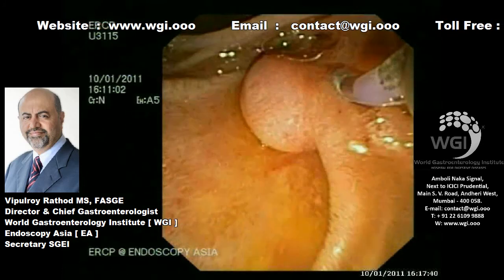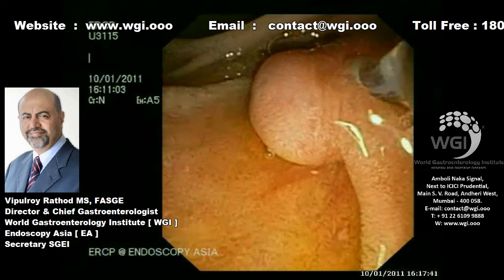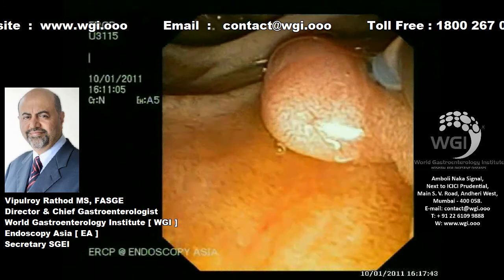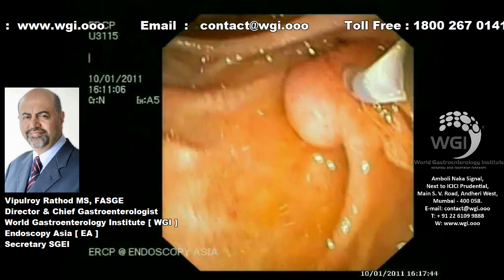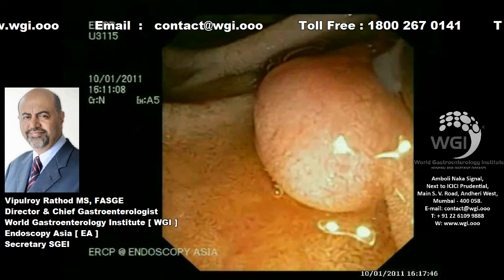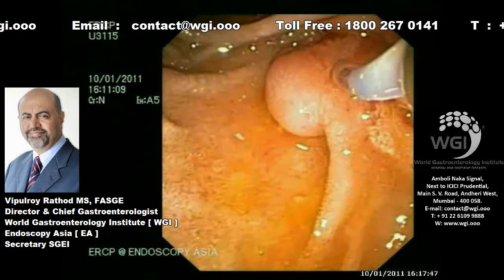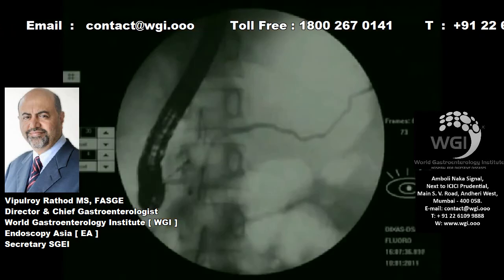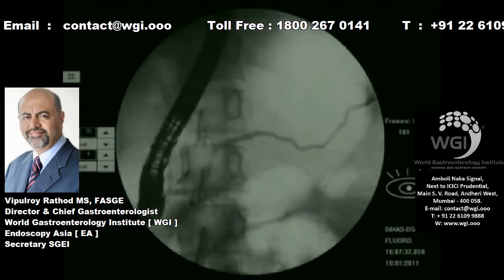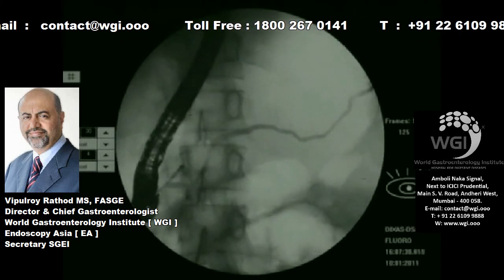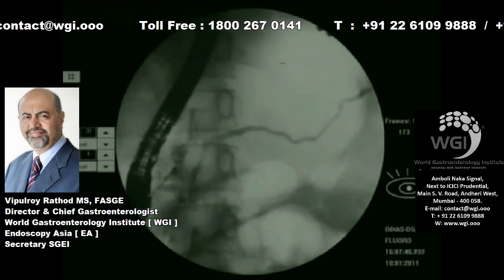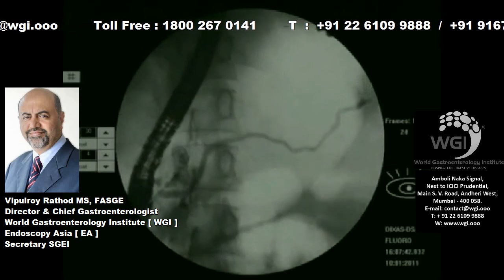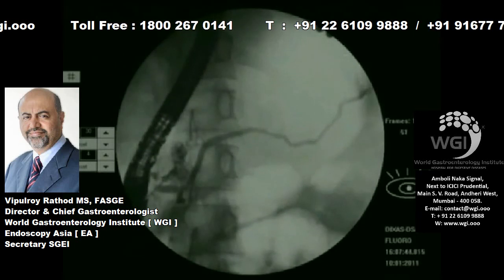Whenever we have patients with prior sphincterotomy — especially biliary sphincterotomy — pancreatic ductal cannulation can become a serious challenge. You can see here that we are seeing essentially the whole duct lining up. There is some communication with the accessory duct visible here.